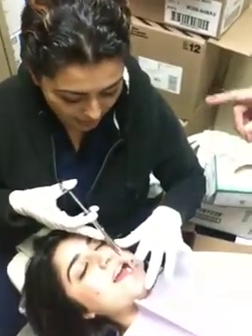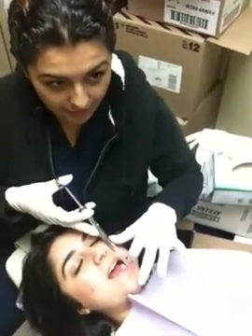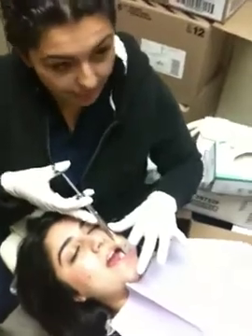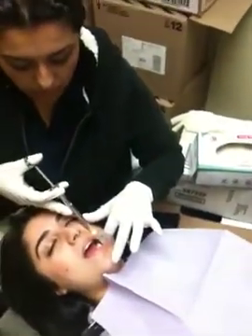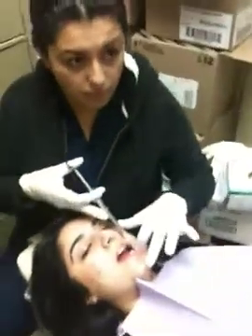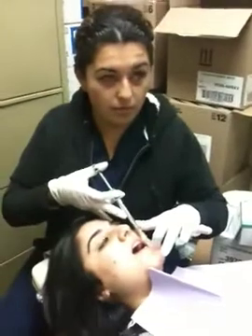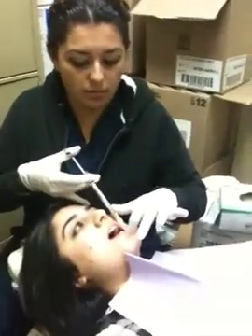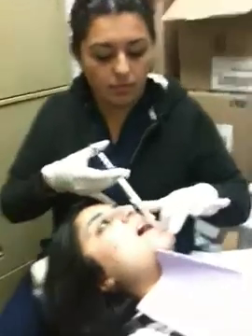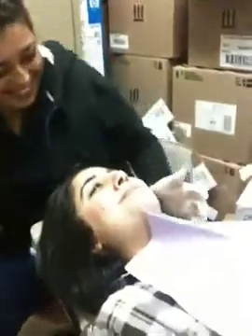What if you want to get all the way toward the back? You aspirate and then you inject — you just go further back, as long as you're going long axis. Negative aspiration? So you do put the middle finger to stabilize. It seems like you could stay here and have her turn towards you. Not to stabilize it with your middle finger like that, but to hold it like that? No, but I like it that way. You can use it that way. Maybe he's uncomfortable with that. Can I let her go? Yeah. Whatever you feel comfortable with.